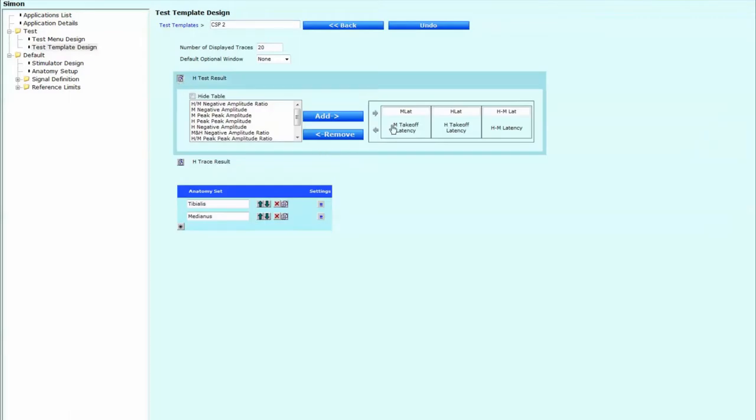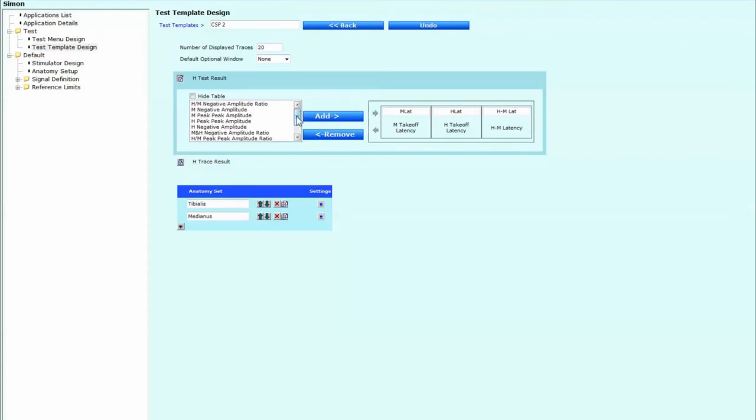The next thing we're going to do is we're going to go down to where it says H test result. And we're going to make sure that in the boxes over here to the right where my cursors are, they'll have the relevant measurements. If you're just coming in from the usual H-reflex program, often you have the amplitudes as well for the M amplitude and H latency and H amplitude, which all come down from this table over here. And all you simply have to do is just locate them in the table and click add to get the latencies across and to remove any amplitudes, which are just cluttering up the screen.